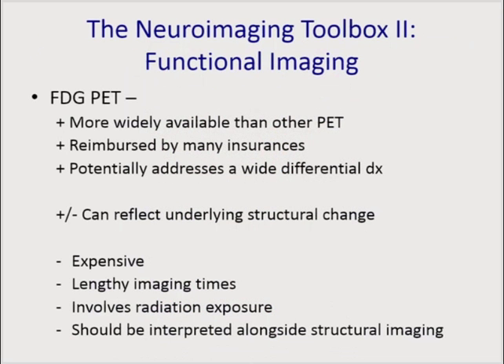So the next major quiver in the neuroimaging toolbox is functional imaging, and probably the most common tool used in that context is FDG PET.